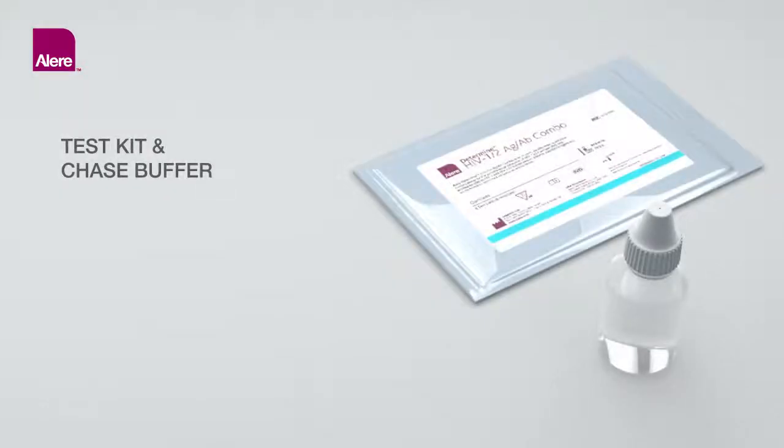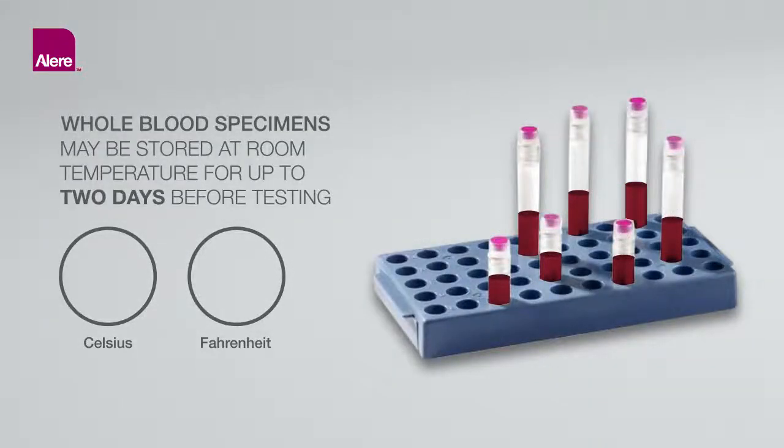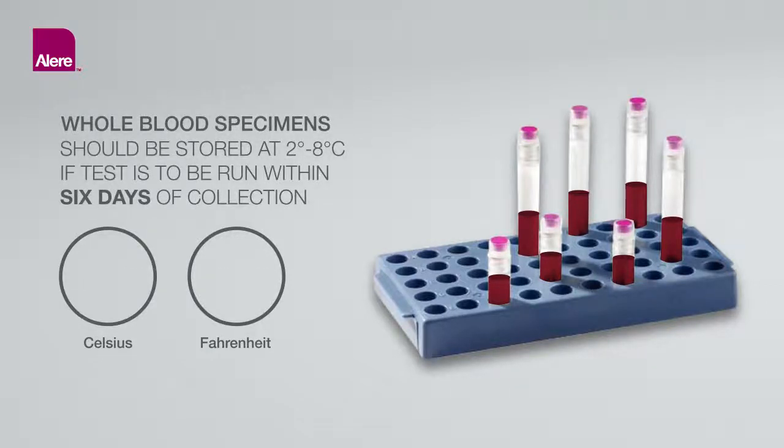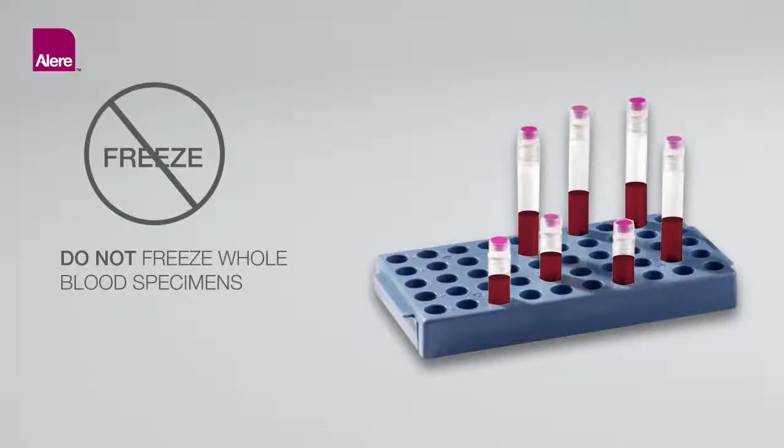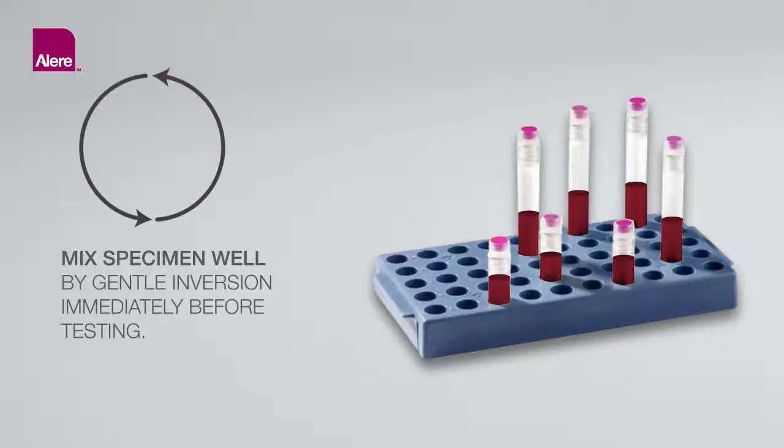Test and Sample Storage Requirements: The test kit or aluminum Ziploc pouch containing test cards and chase buffer must be stored at 2–30 degrees Celsius or 36–86 degrees Fahrenheit until expiration date. Whole blood collected by venipuncture may be stored at room temperature, 15–30 degrees Celsius, for up to 2 days before testing. If testing will not be performed within 2 days, store at 2–8 degrees Celsius if the test is to be run within 6 days of collection. Do not freeze whole blood specimens. If stored at 2–8 degrees Celsius, bring specimen to room temperature before testing and mix well by gentle inversion immediately before testing.